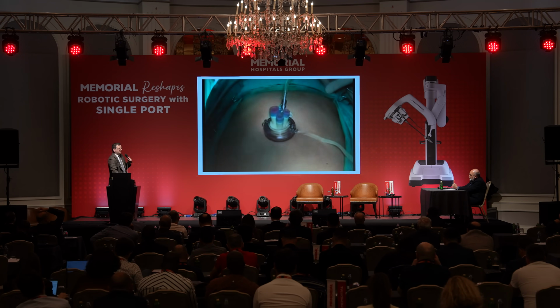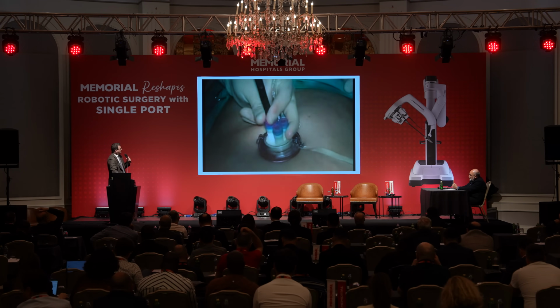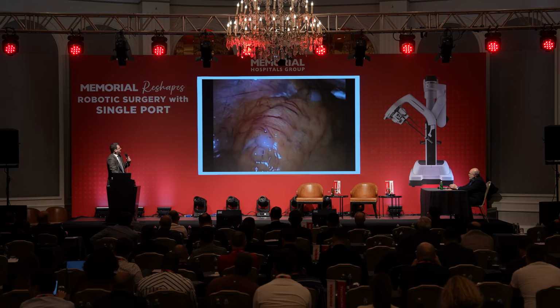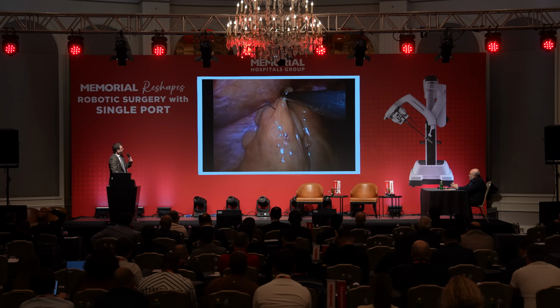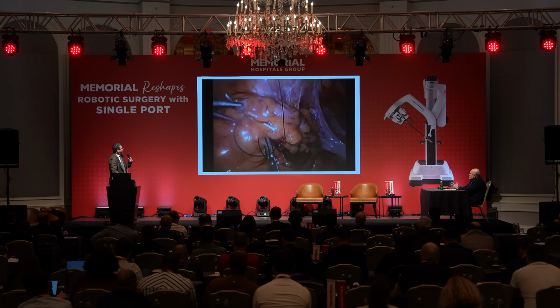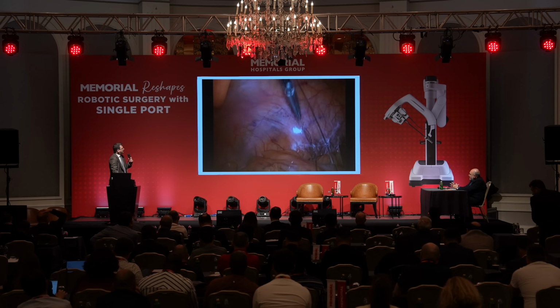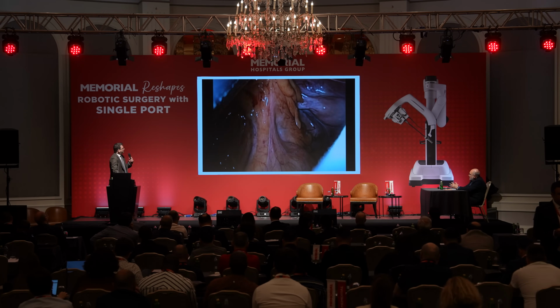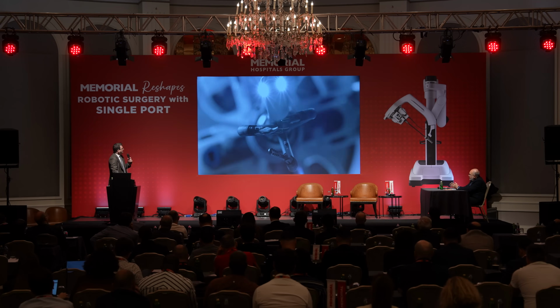If you send this video to any journal right now, you will be rejected in 10 seconds. But this was the very first and the most advanced visual technology that we had at the time, in the early 2010s, and we were trying to create triangulation with different approaches, by tacking the sigmoid colon to the abdominal wall, all to try to create proper traction and countertraction for the operation.